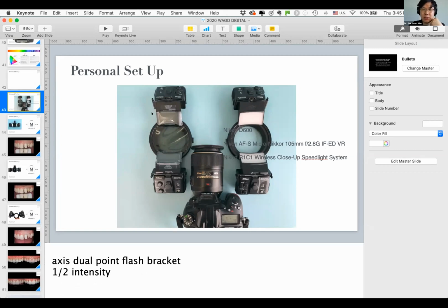So let's say you have a sheet of the polarizing filter. I use a marker and put a dot here and a dot here. If you cut everything parallel to each other and put them to the side, it won't cross polarize. You need one paper going this way. You have to almost imagine that the papers have a line going through like this. So you cut one this way, and the other one has to be cut so that it's turned this way. When you have those polarizing filters at a perpendicular angle, this is when the light gets crossed out.